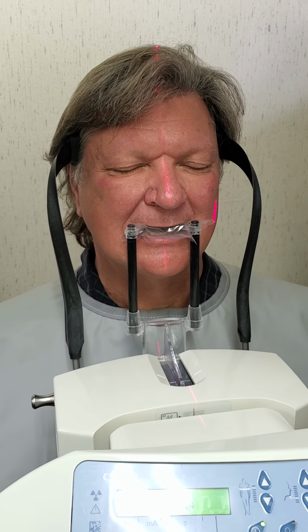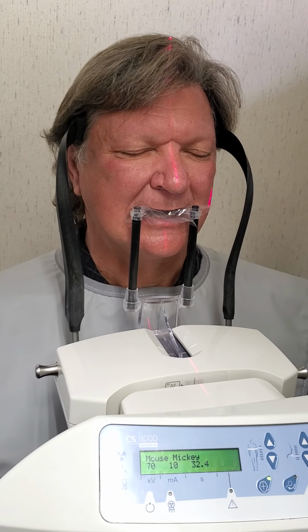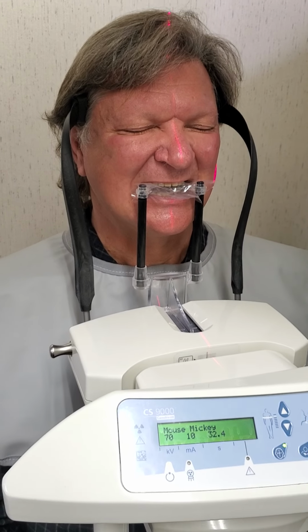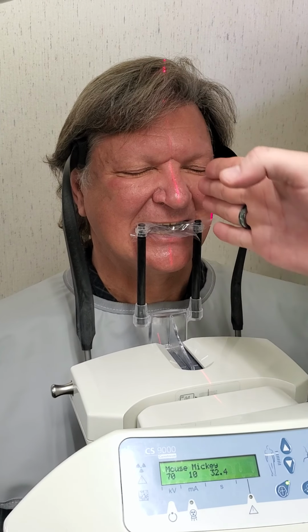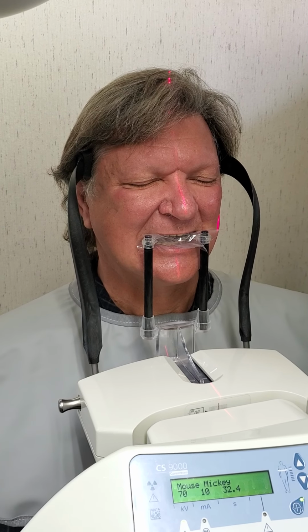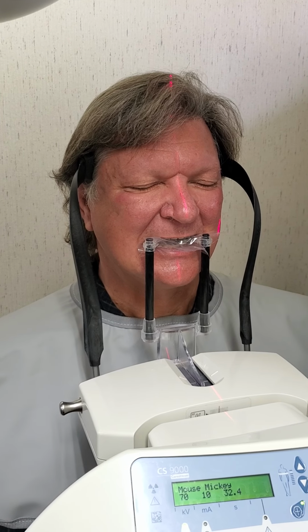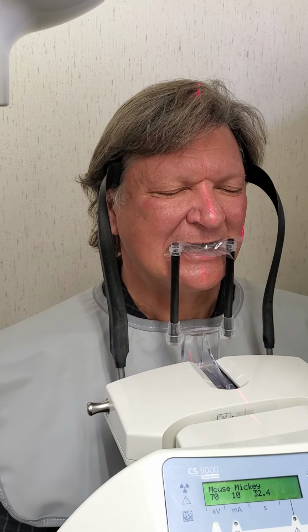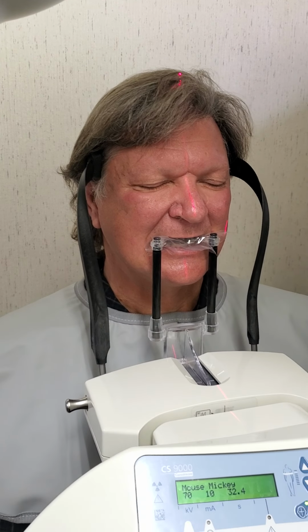Now, do you want to make sure that, like, if we have crooked noses or anything like that, not only watching the midline of the face, but also the midline of the arch? Right. So you want it right down the midline of the face. It should line up with the midline of the arch. Perfect. But the midline of the arch is the more important aspect. So if they have a Tom Cruise deviation, you're going to change it. Correct. All right.